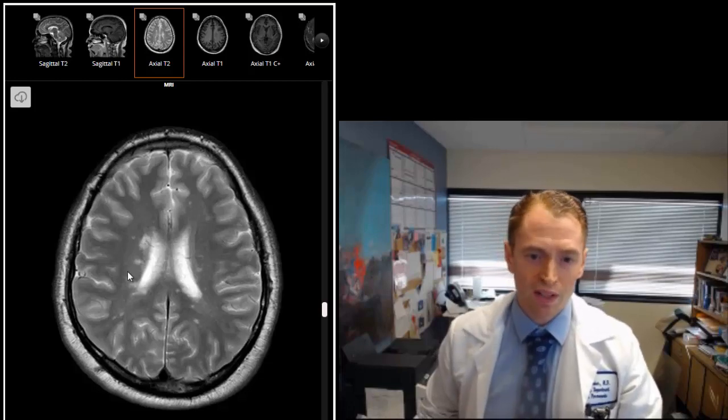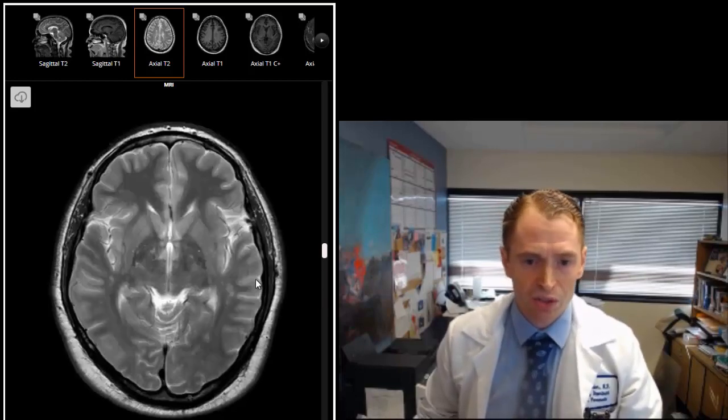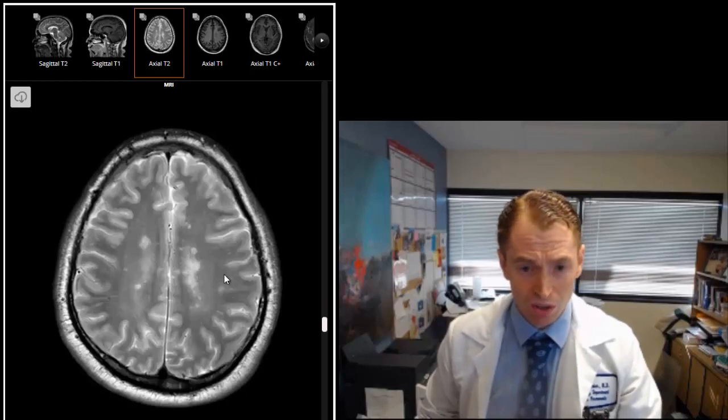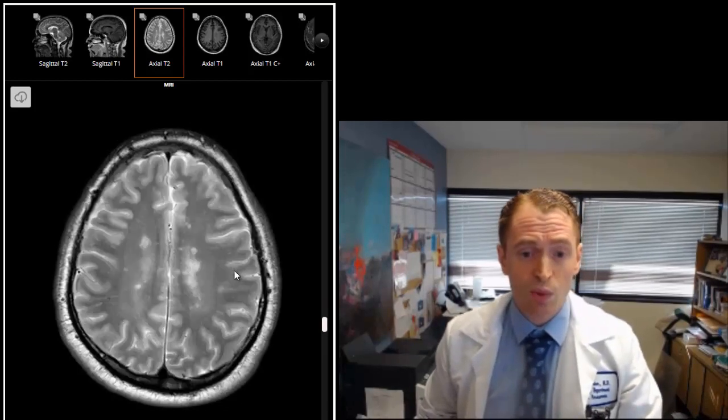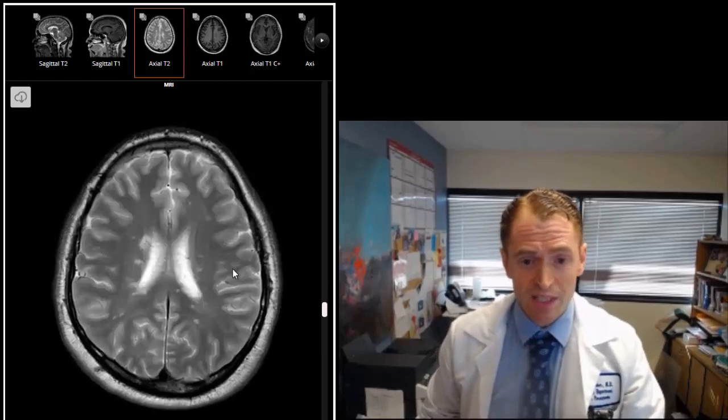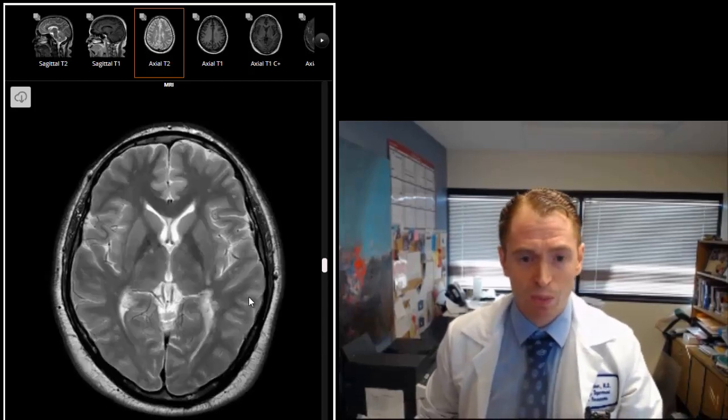This is sort of the picture that you would show to a medical student or a junior resident to show them what MS is supposed to look like. Of course there are a lot of variation from person to person. Not everyone has classic findings but this is like sort of a textbook MRI of someone with MS.